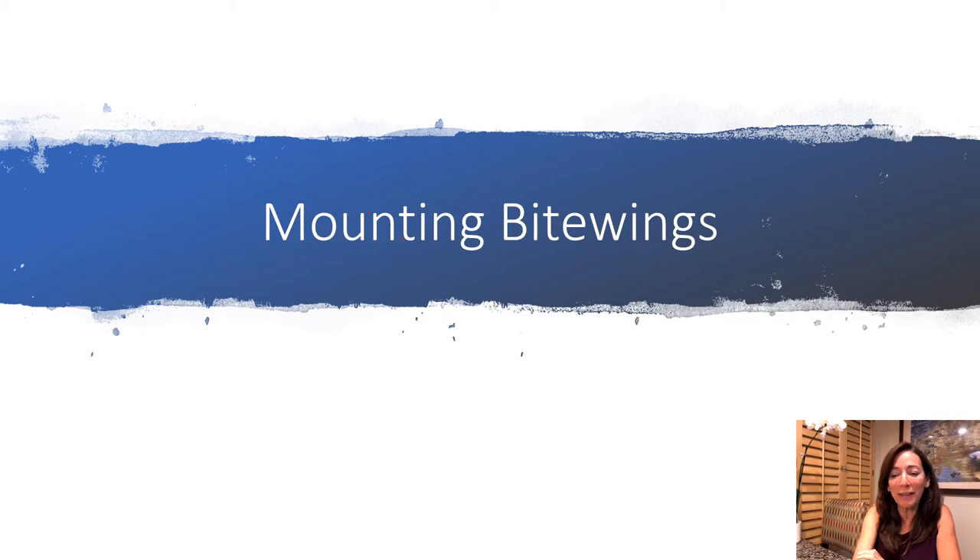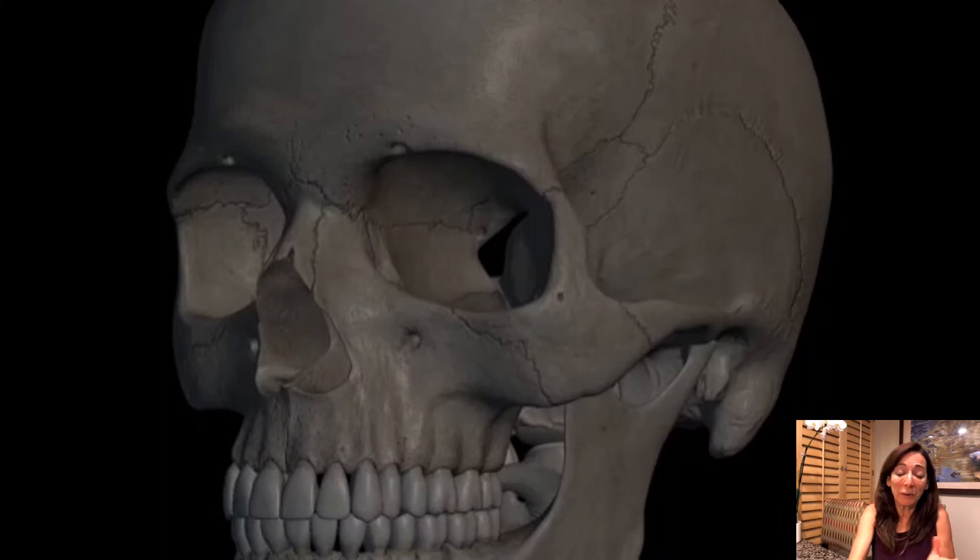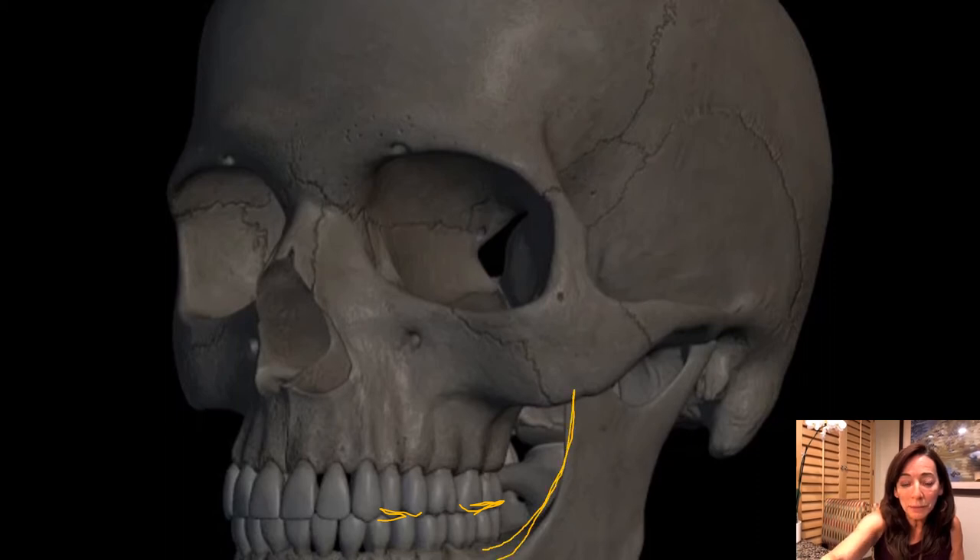It's the same thing with x-rays. When we take an x-ray, we're basically pulling the cheeks, pulling the lips back, pulling away the muscles — it's almost like showing the doctor a dissected skull. Here you can see the molars in the back and the premolars more toward the midline, or the mesial. The premolars are more anterior; the molars are back farther, going to the outside of the picture. And here you see the rising ramus in the back.